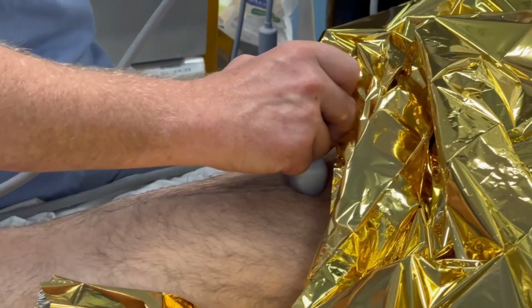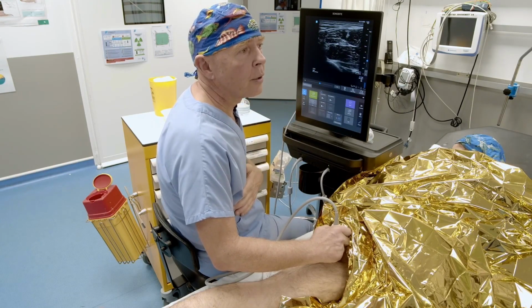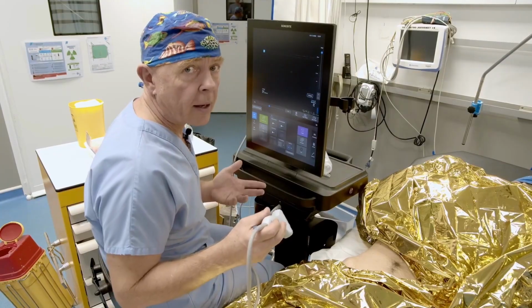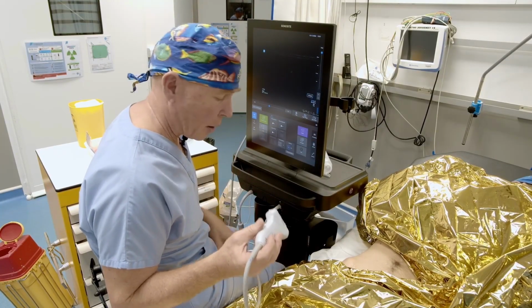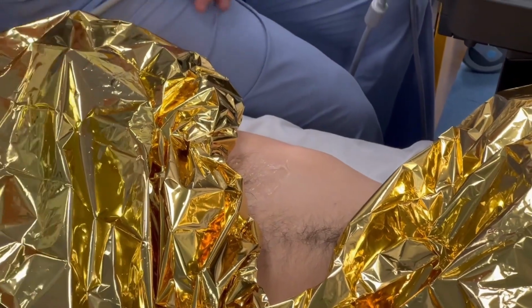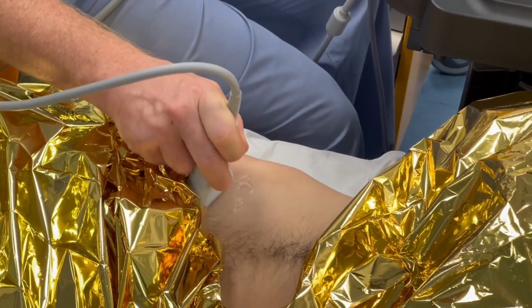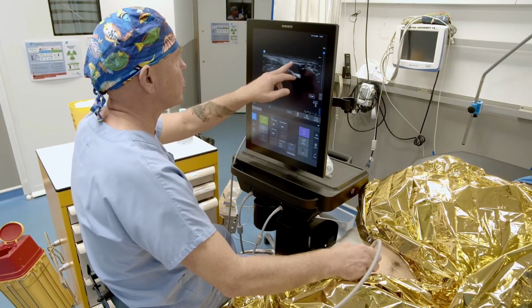So now we're going to turn around and do the femoral block and the iliofascial block via the suprainguinal approach, and we'll finish with the table. So now we're going to move on to the practical workshop for the femoral nerve block. You see the position of the probe as always. My landmark on the outer side and my hand firmly stable on the patient. We've seen a little bit, we can identify the anatomical structures, and we can rock the probe a bit to see everything. My main landmark is therefore the femoral artery.